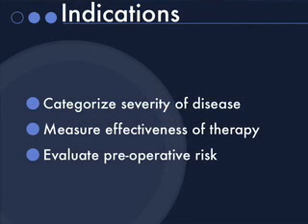The second indication is to categorize the severity of the disease. The other indications for spirometry in an office setting are categorizing the severity of a disease, measuring the effectiveness of therapy, and evaluating the preoperative risk.